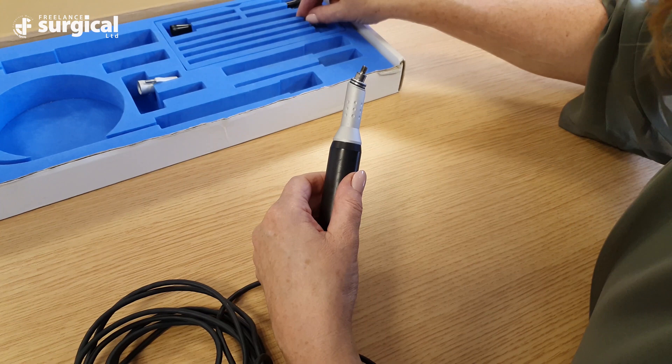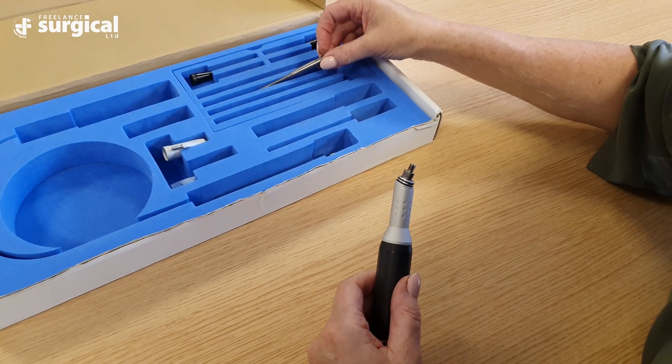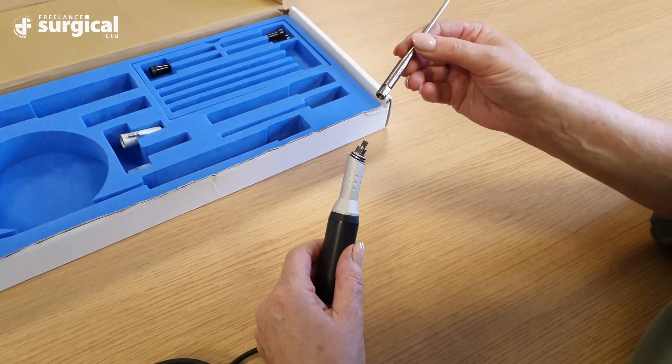Next, select the most suitable tip for the surgery to be undertaken. Hand tighten the tip onto the handpiece.